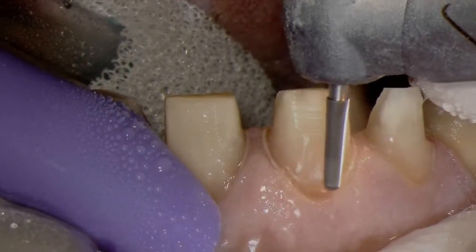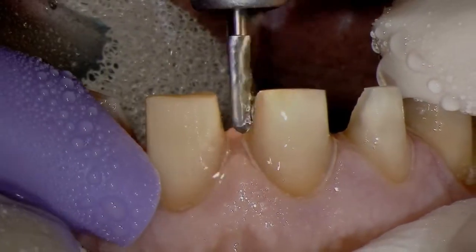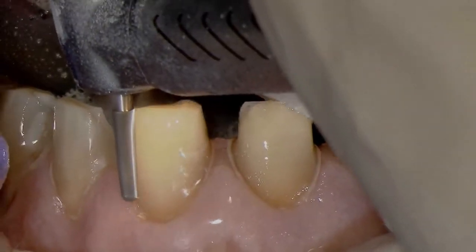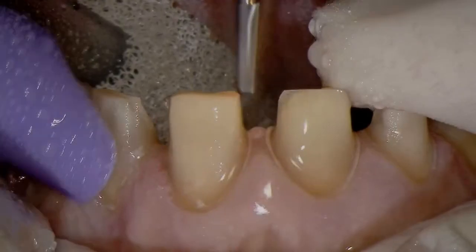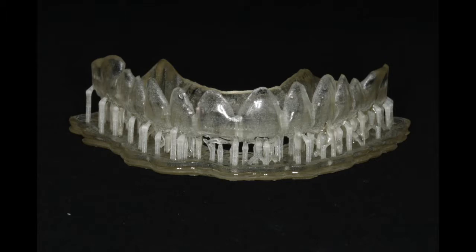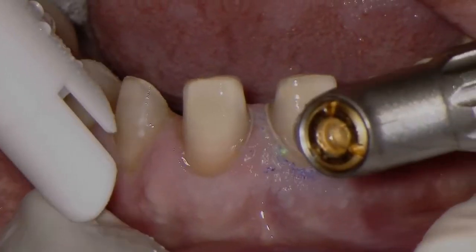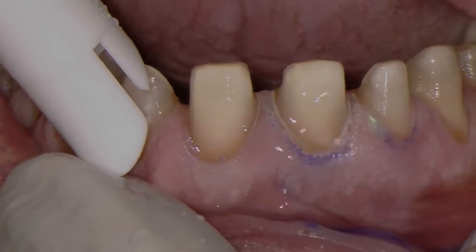So tooth preparation was carried out. Some gingival crown lengthening was required on teeth number 7 and 8. So we used a Soleil laser. We also used the Splint software to fabricate a guide that we transferred with a marker how much we wanted to use for crown lengthening. That then also helps as a tooth reduction guide.